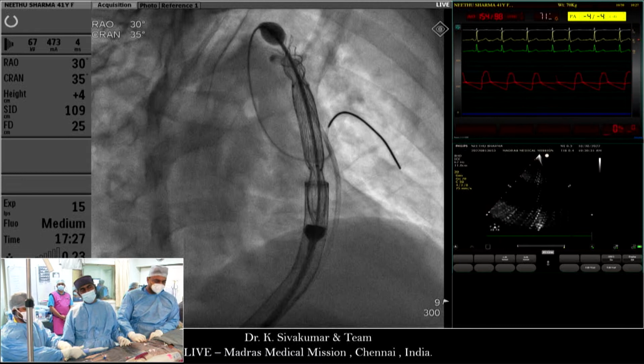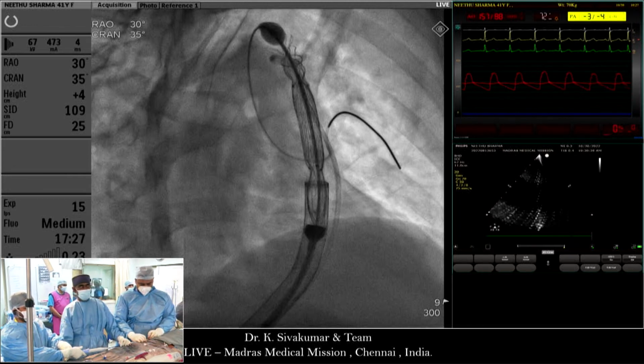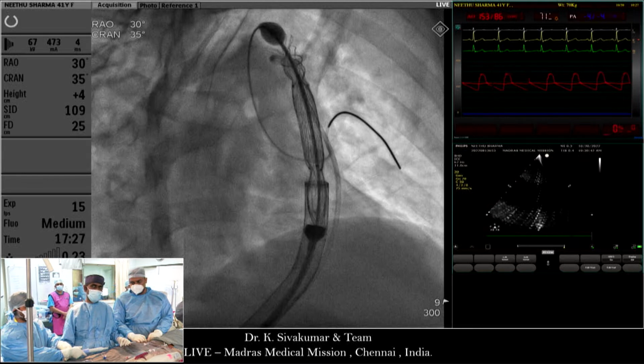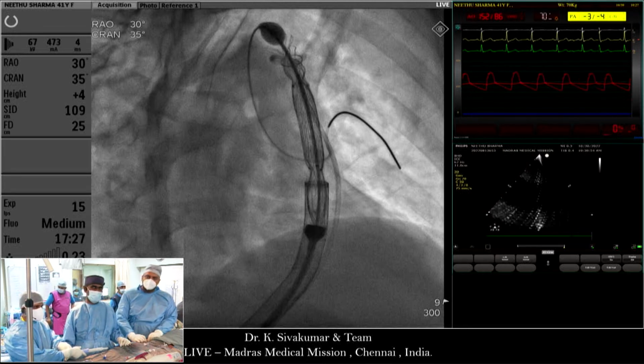But on a shallow RAO and a shallow LAO cranial, our RAO was around 37 and LAO was somewhere around 40. In those frames, we were getting a little less, 32. So I feel that it is an anteroposteriorly oval outflow tract, which is reasonable to expect with a transannular patch, native outflow tract.